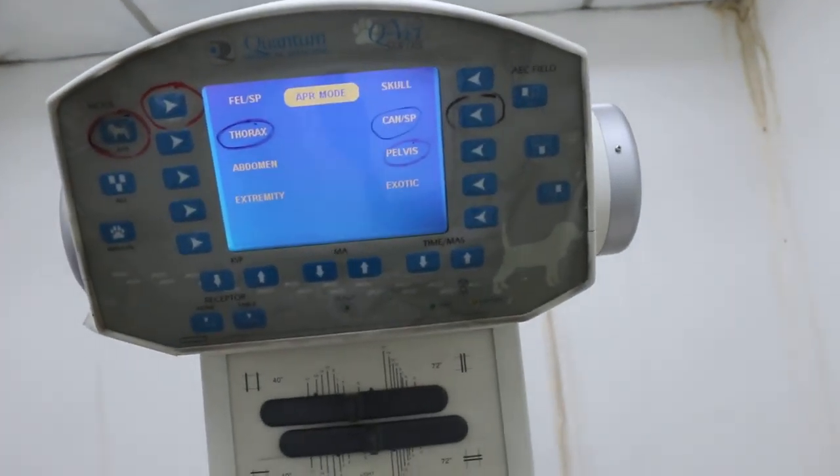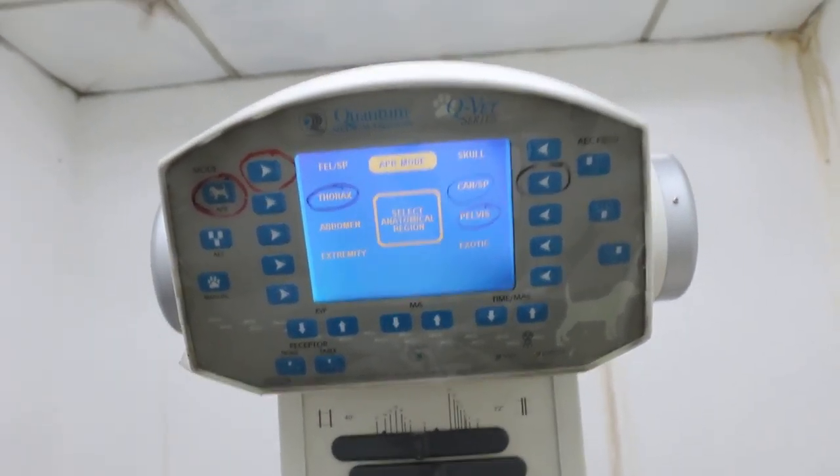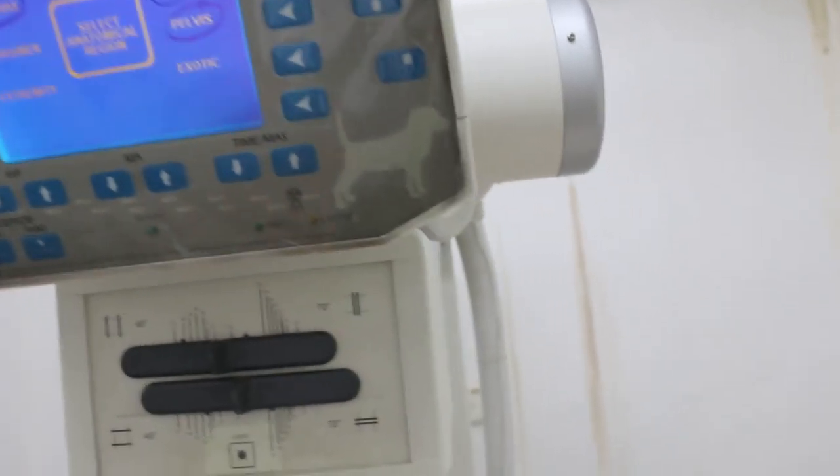You do the setting first. It will be moving, so do everything — all the settings first.